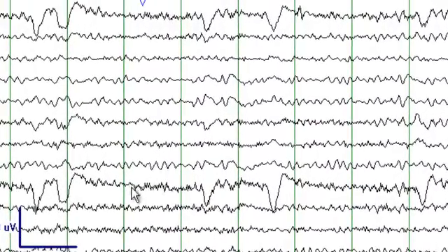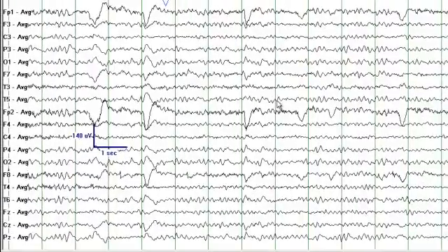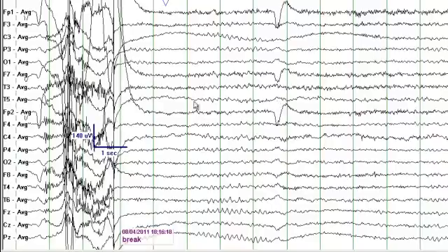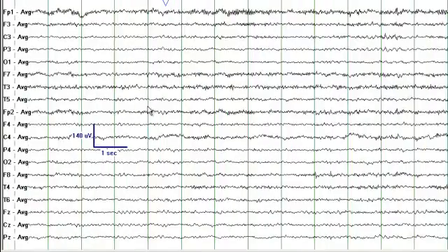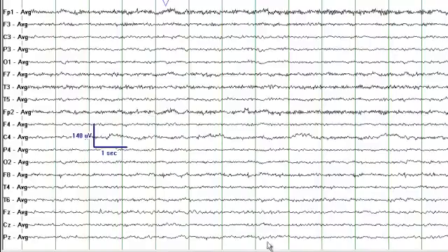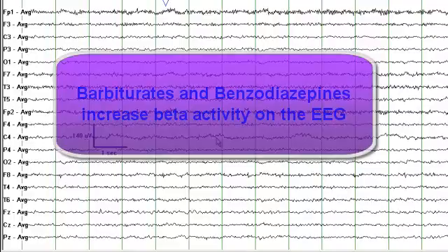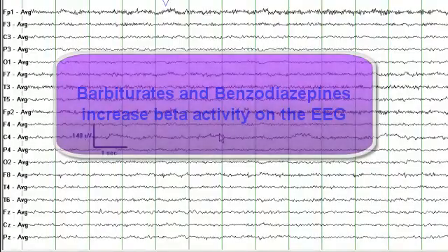You see more beta frequencies in the frontal head region, eye blinks, and a posterior dominant theta-to-alpha rhythm. There is also some electrode artifact. Patients taking barbiturates or benzodiazepines tend to display more beta frequencies on the EEG.